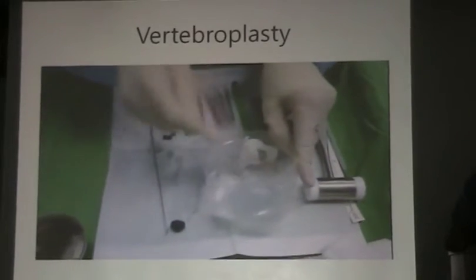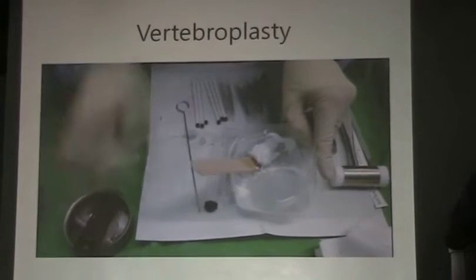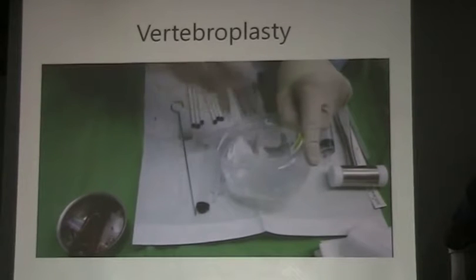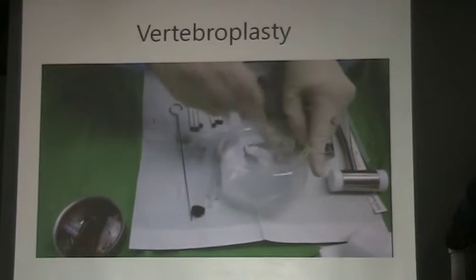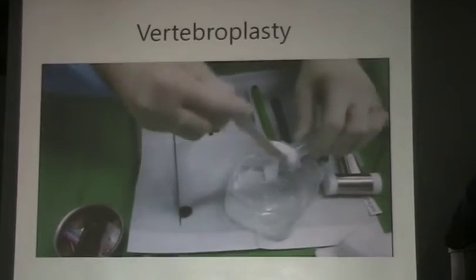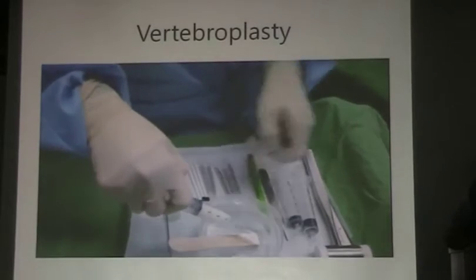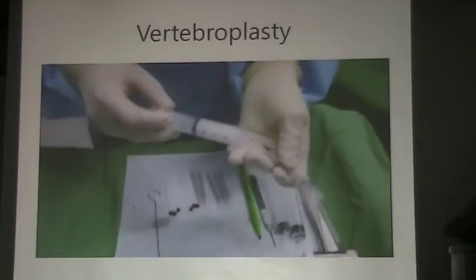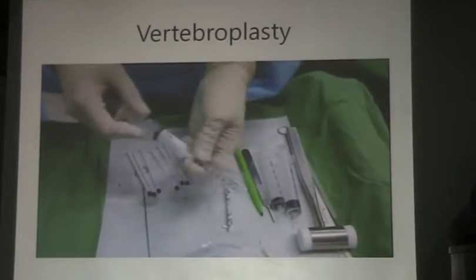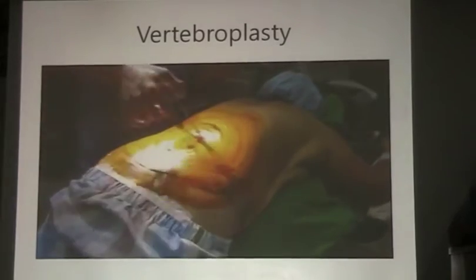My scrub nurse mixes the cement powder with solution like this, and then inserts the cement into a 20 cc syringe. Then transfer the bone cement into 1 cc syringes like this. And prepare the operation field.